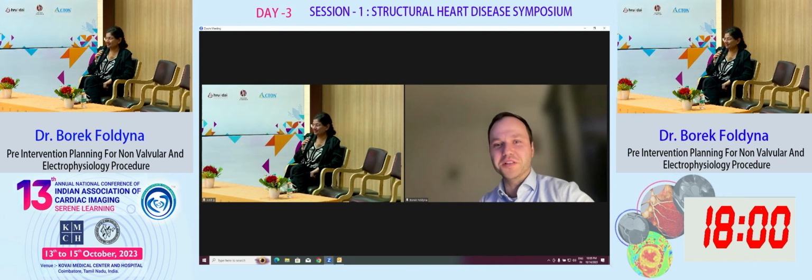Great. Do you measure the? No, but a lot of times we get asked for scarring within the left atrium and atrial scarring, because that is definitely going to have relevance in the future. But no, we haven't been quantifying it, but I think we're going to have to get there. Yeah, procedurally, yes, you can clearly see the scars after a PVI. But really in patients who are getting a PVI for the first time, we usually don't do it on a daily basis, no. Great. Cool.